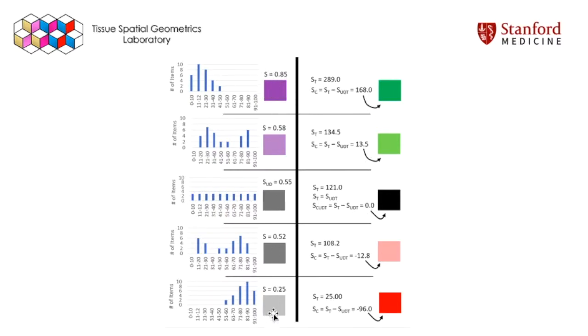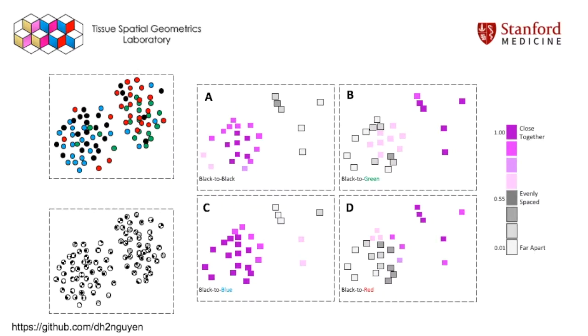And so these methods, the NHS score allows you to capture the information in a spatial distribution in the form of a histogram into a single number. And these numbers can then be translated into a color coding system. The ultimate advantage is what?